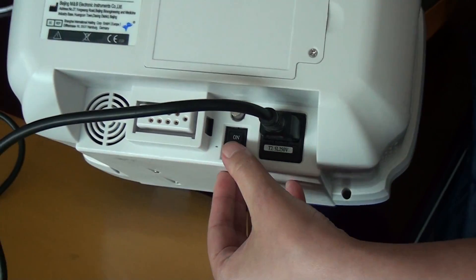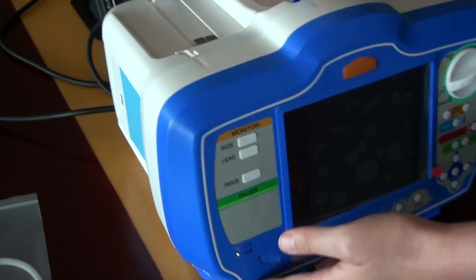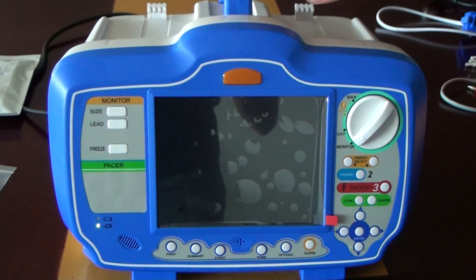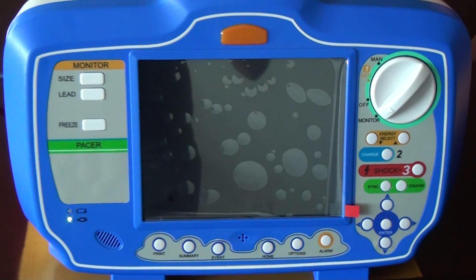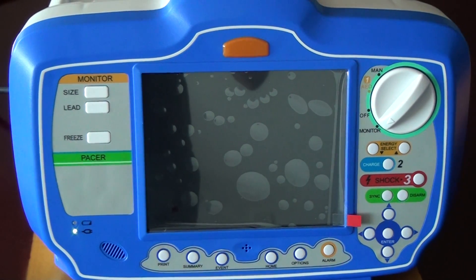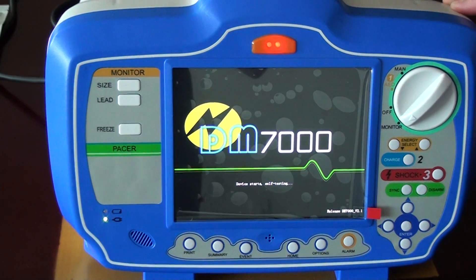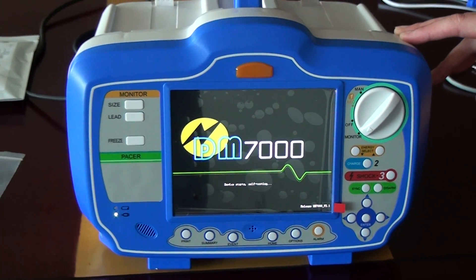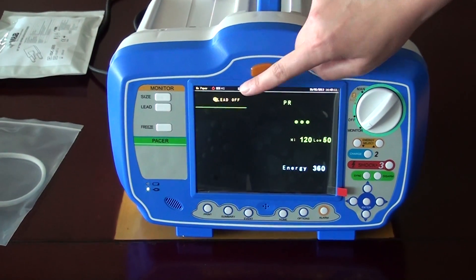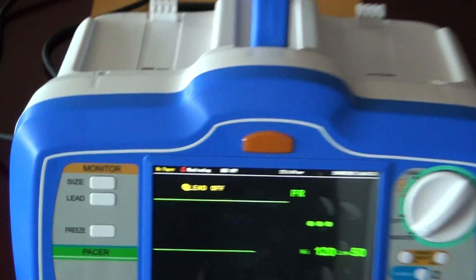Now we turn on the device. Put the power source and turn on. Enter the monitor. Now it shows 'lead off', which means that we need to connect the ECG cable.